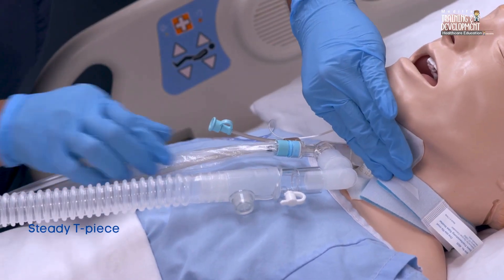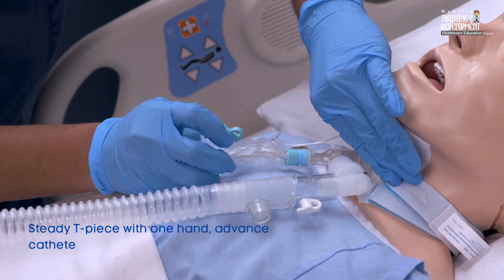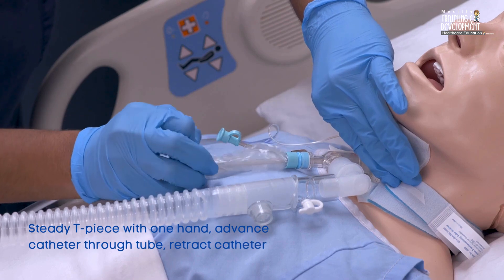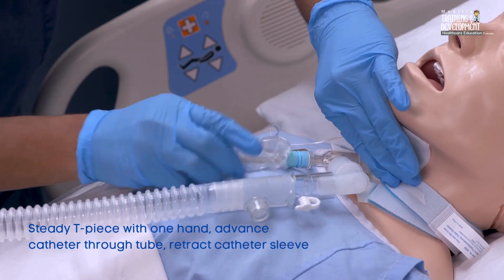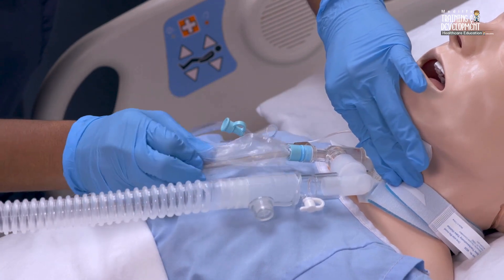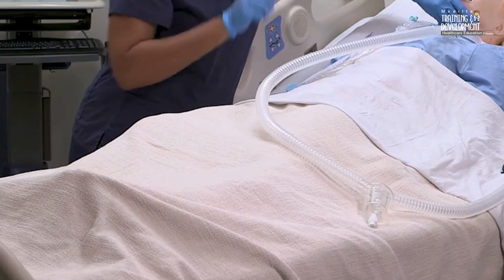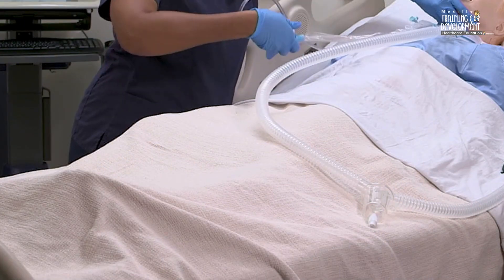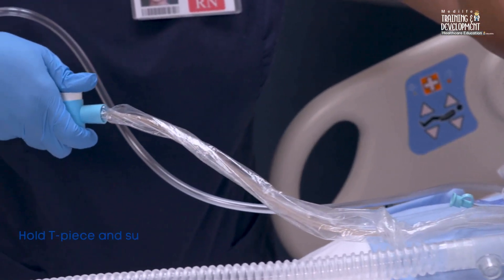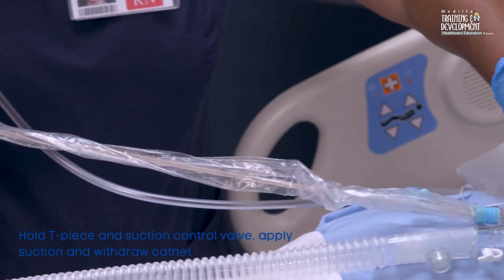Steadying the T-piece with one hand, use the thumb and index finger of your other hand to advance the catheter through the tracheostomy tube until you meet resistance or the patient coughs. Gently retract the catheter sleeve as you advance the catheter. While continuing to hold the T-piece and suction control valve and applying suction, withdraw the catheter until it reaches its fully extended length in the sleeve.